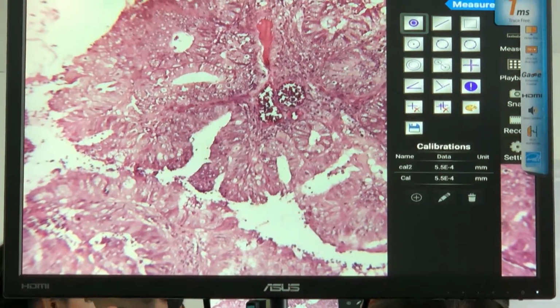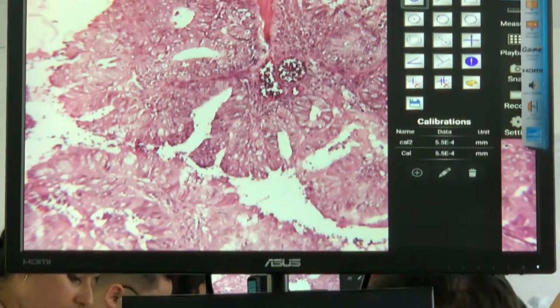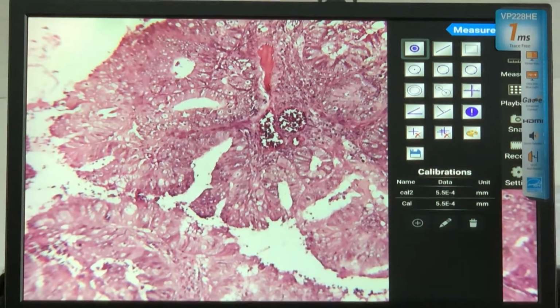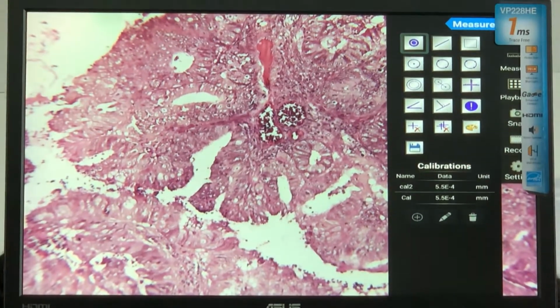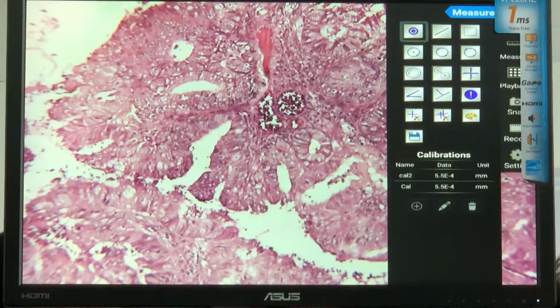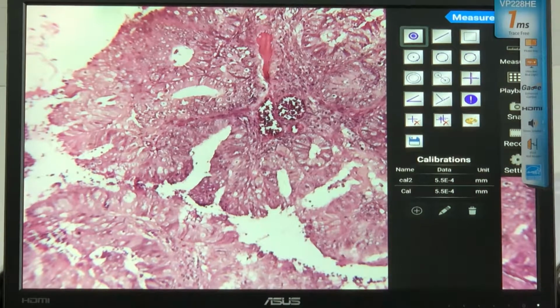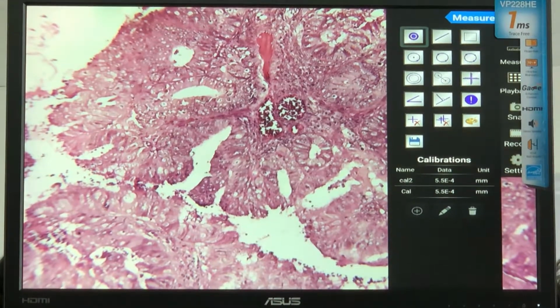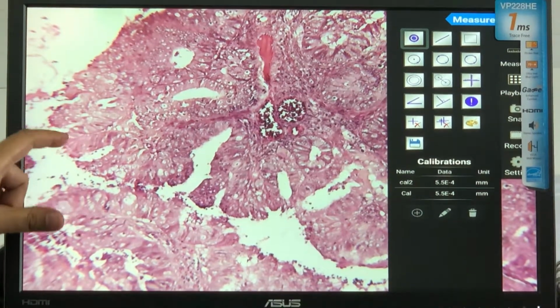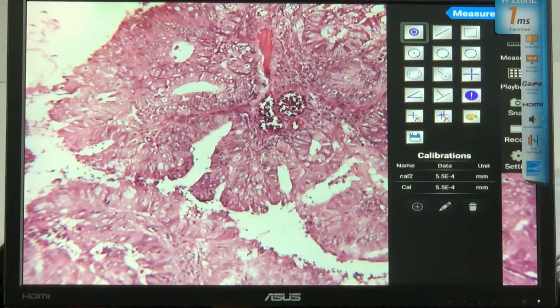No. Yes, of course, because this is already pathologic. That's why it's called endometrial hyperplasia. There are plenty of nuclei. You see those nuclei, they are not like simple columnar. Simple columnar has one layer of nucleus. So you will see the violet things or those circles inside. How many circles did you see inside? I think layers of 2, 3. Right? Like that. Layers of 2 or 3.